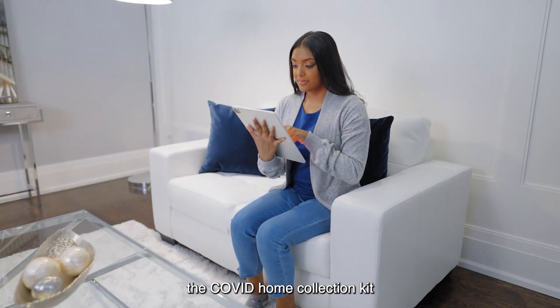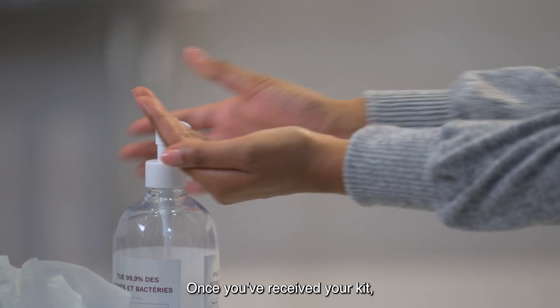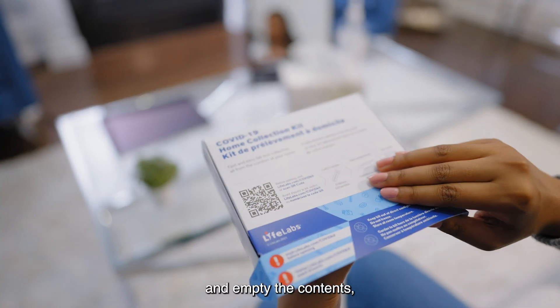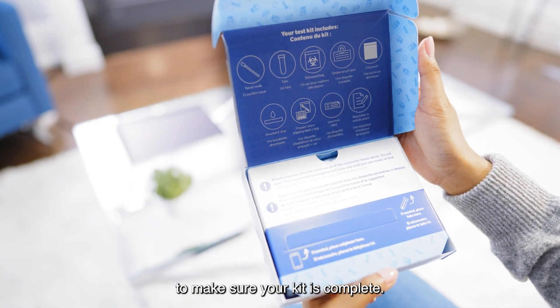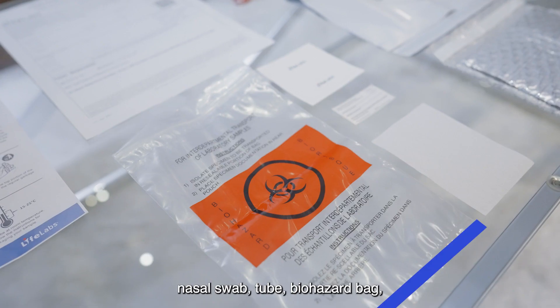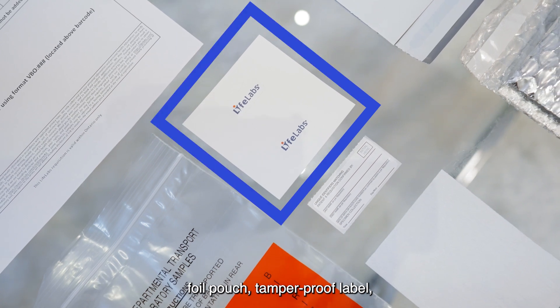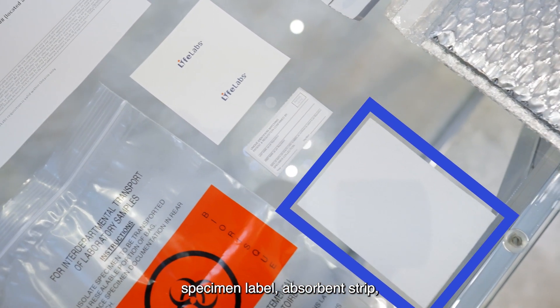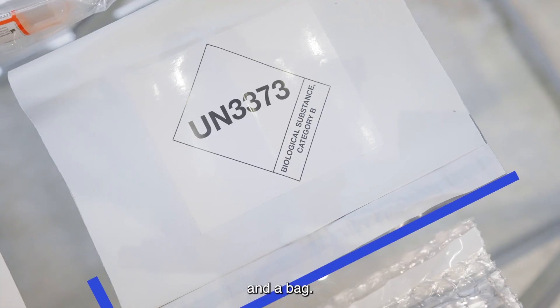Welcome and thank you for choosing the COVID Home Collection Kit by LifeLabs. Once you've received your kit, sanitize your hands, then open the box and empty the contents, following the items on the box flap to make sure your kit is complete. Your kit will contain a nasal swab, tube, biohazard bag, foil pouch, tamper-proof label, specimen label, absorbent strip, a requisition, kit instructions, and a bag.